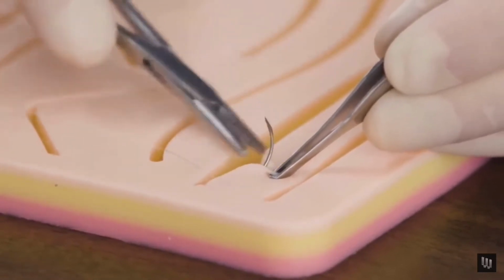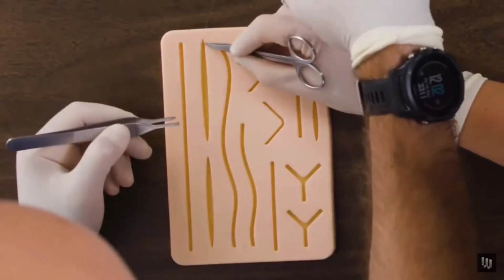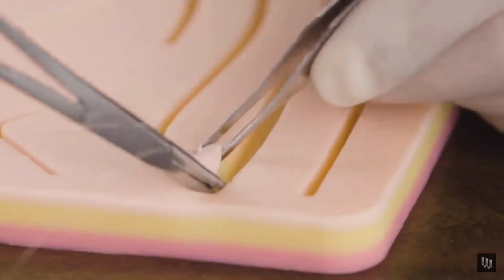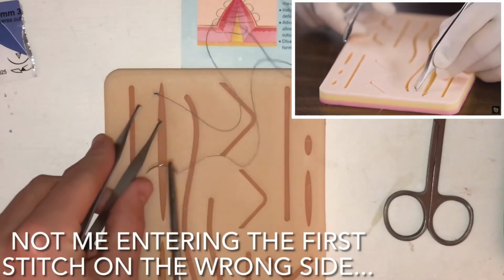And if you're super slick, you'll load your needle while it's held down there for you. Okay, so you're actually going to come along this dimension. Okay. Yeah. Like so. Again, use your pickups to put the tissue where you want it to go. Put the tissue where I want it to go. I am stuck, but that's enough to get it out, I hope.